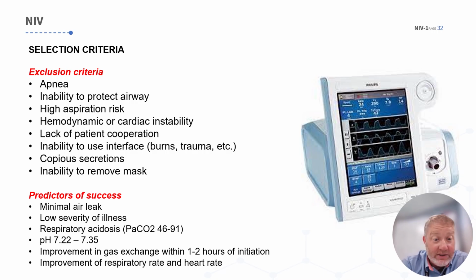Predictors of NIV success: minimal leak, of course, low severity of illness, obviously. So a reasonable respiratory acidosis, they're really good at correcting. And you should see improvement in gas exchange on the blood gas results within 1 to 2 hours of initiation.